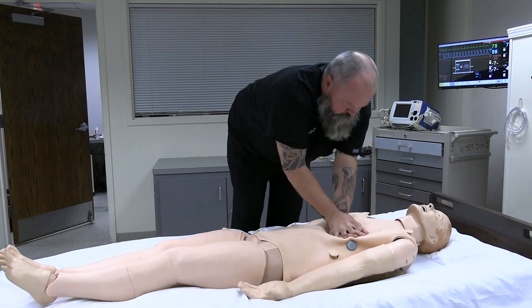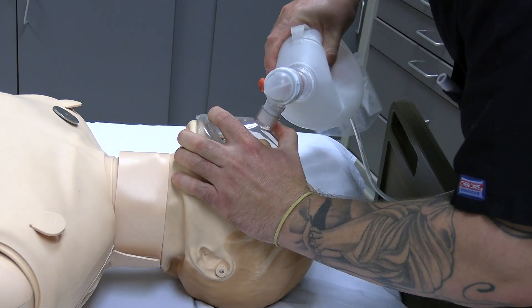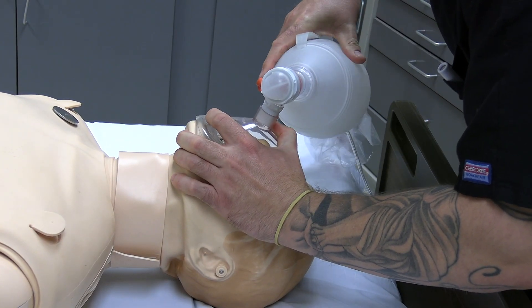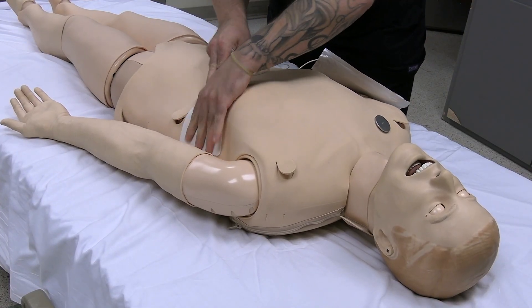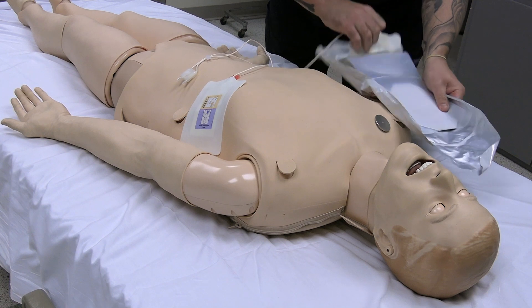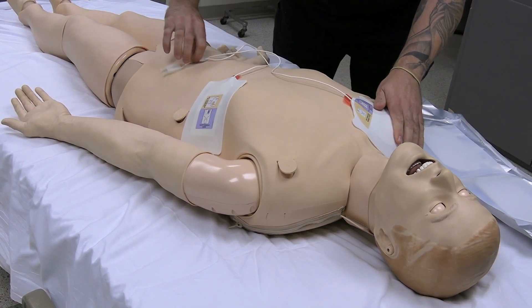CPR can be performed full-on giving compressions and breaths. You can also use oxygen delivery devices like a bag valve mask to create manual chest rise. We can also deliver a live shock to the mannequin for cardiac events using a real defibrillator. Always be sure to clear the area when delivering a live shock.